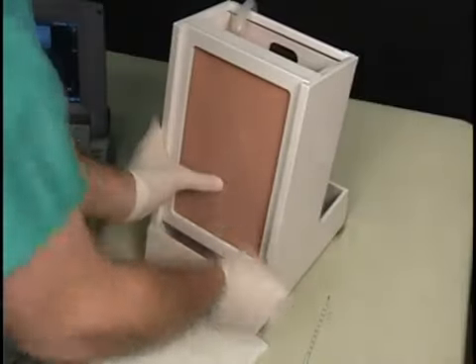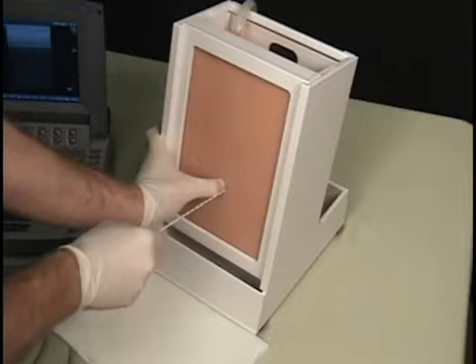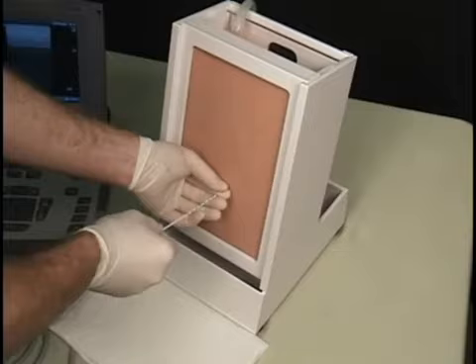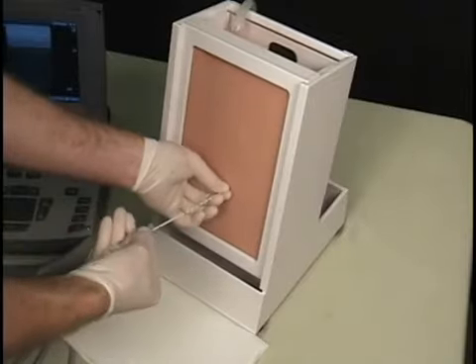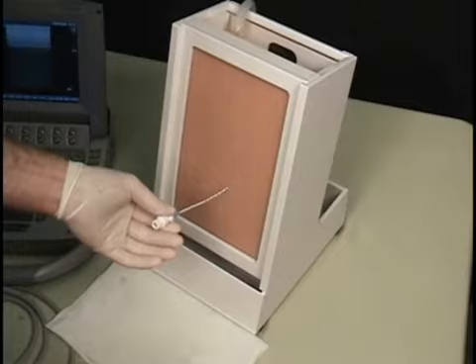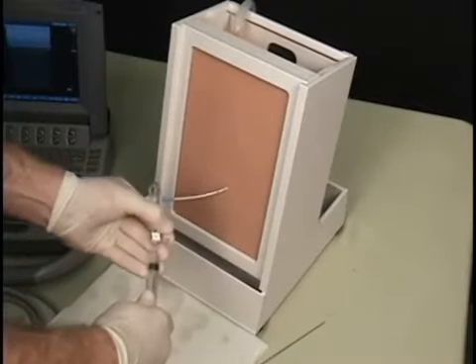The thoracentesis procedure can be completed repeatedly on the model's durable tissue, including full cannulation and the removal of fluid. During the procedure, a pop will be felt when the pleura is penetrated, and the tissue will respond to the Thoracentesis catheter drainage system's color safety indicator. A positive fluid flow will confirm that the pleural effusion was accurately accessed.